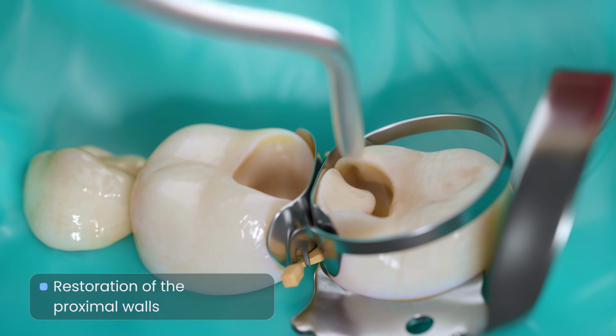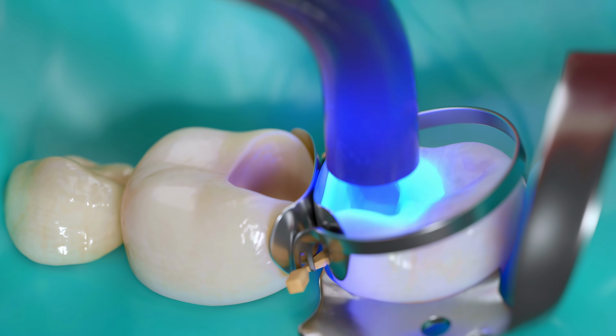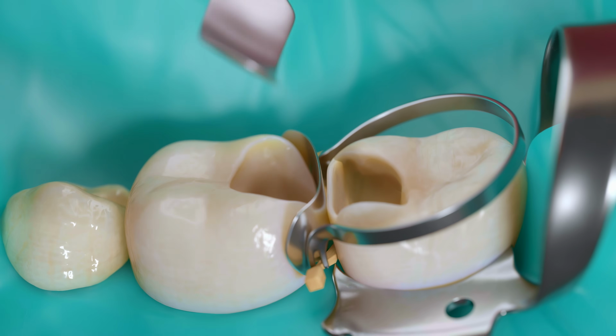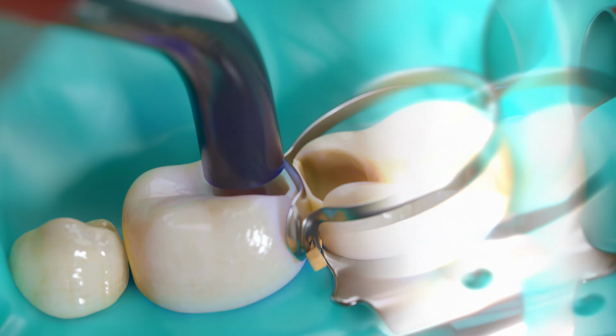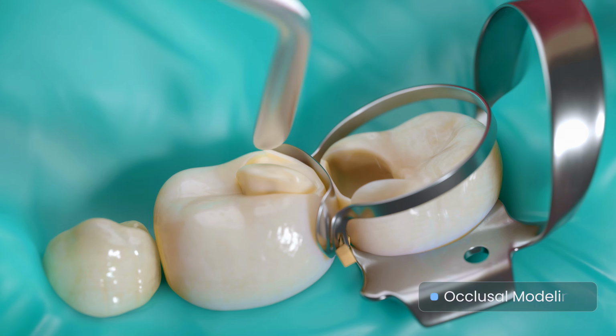The first step in restoring tooth anatomy is the formation of the proximal walls. Each increment of composite material is cured separately. The cavity is filled with a composite in a layered manner, carefully adapting each increment to the margins and shaping the tooth anatomy.